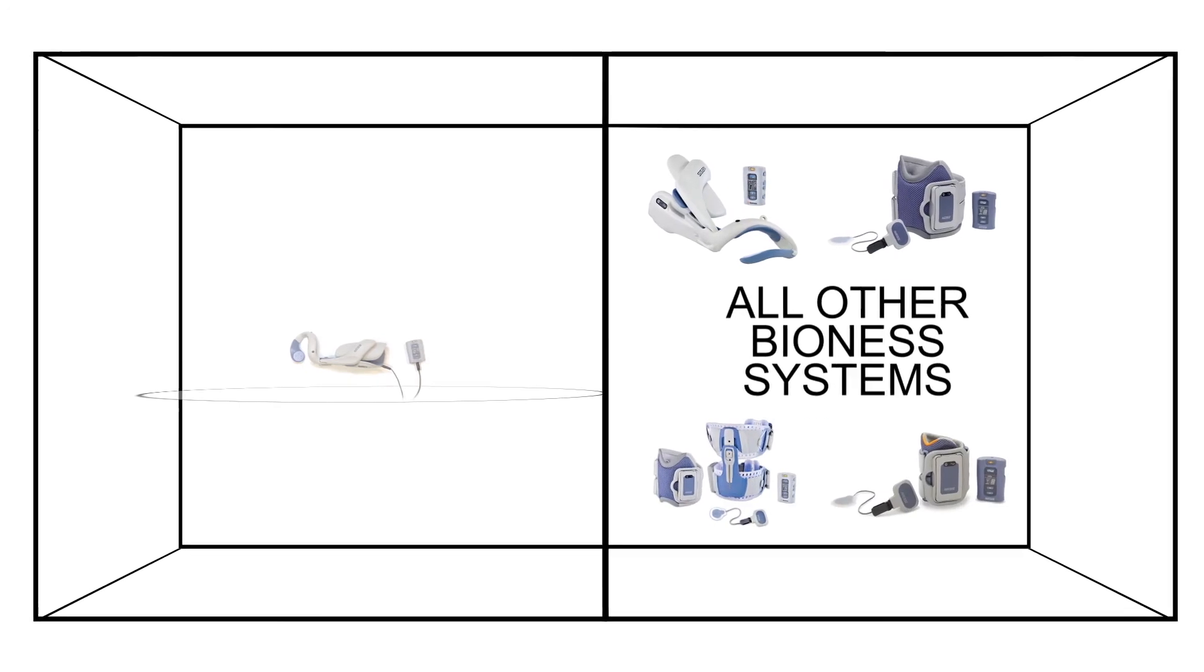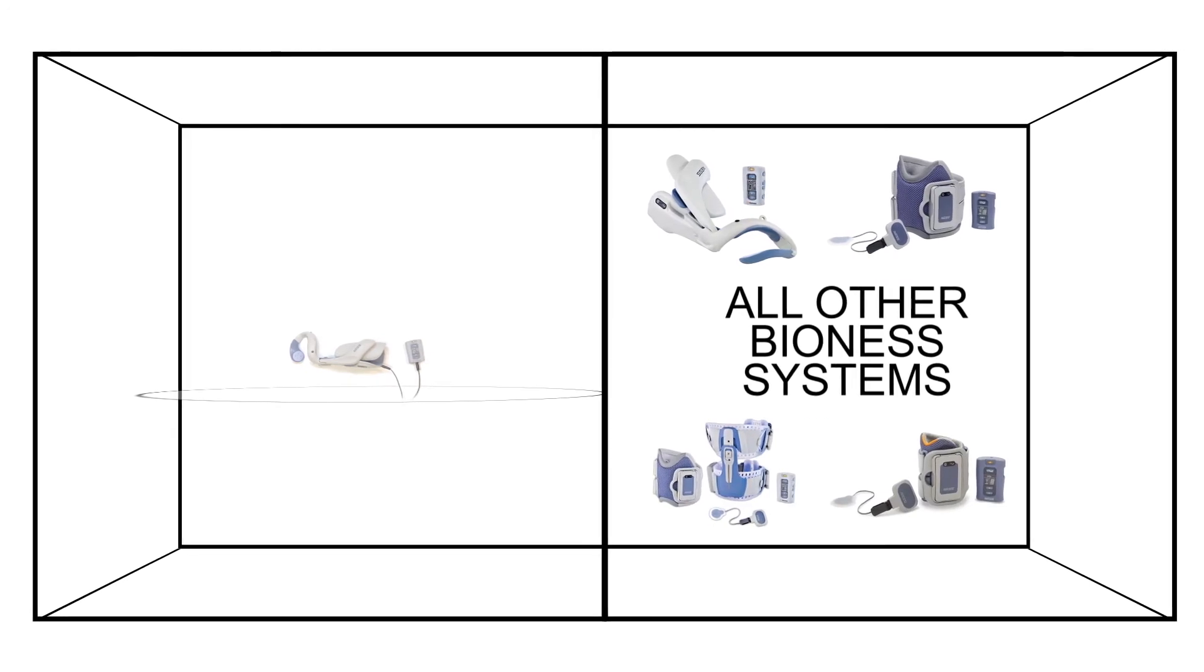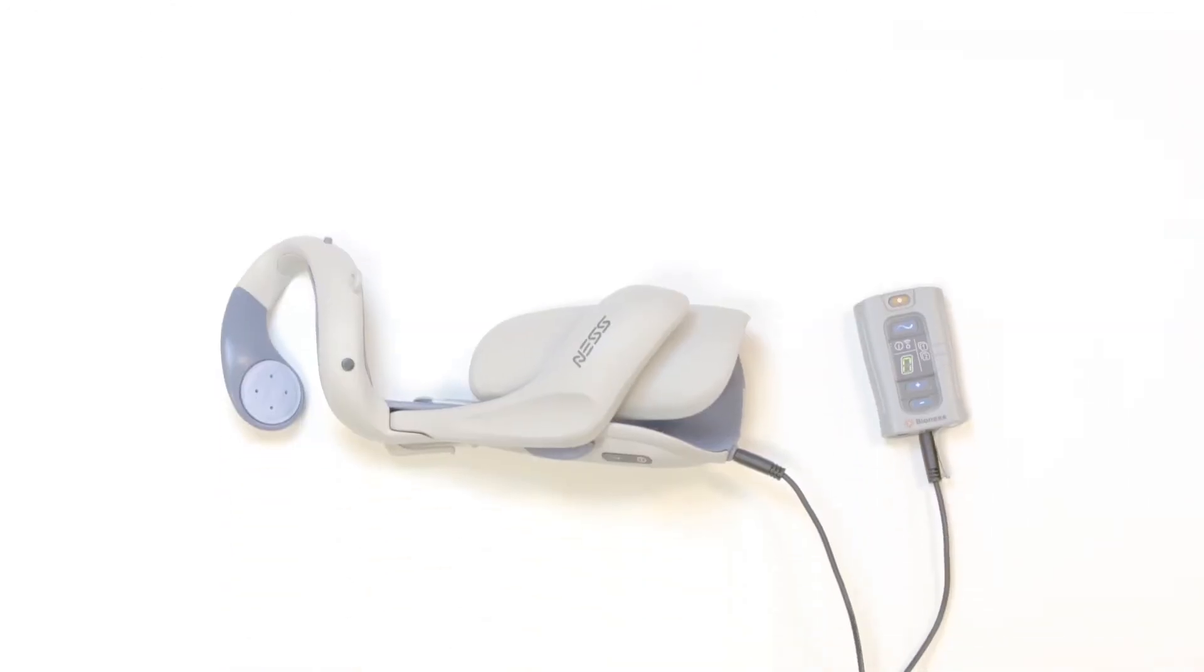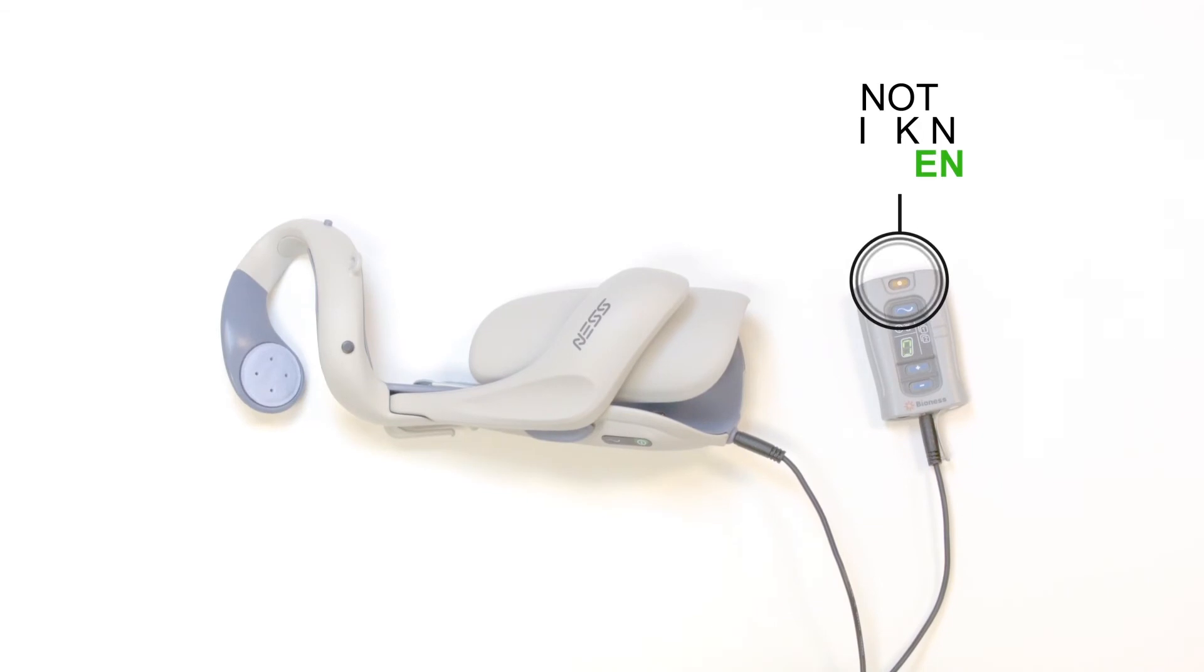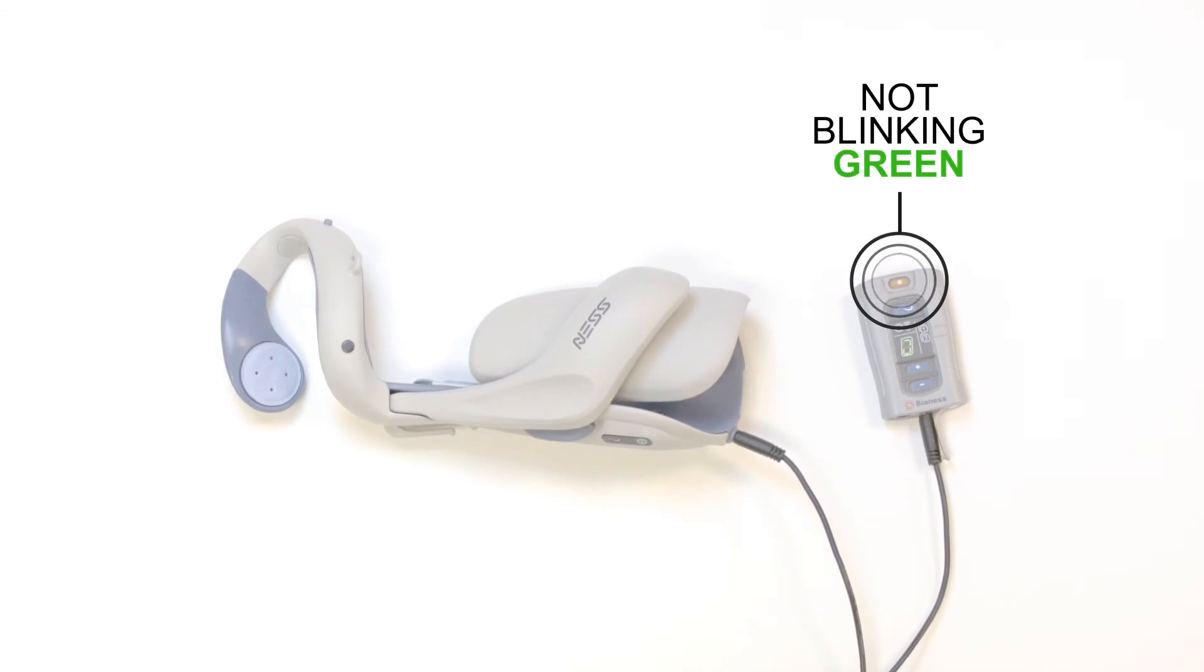It's important not to link your components to another system. Make sure your system is turned off. The power green button should not be blinking.